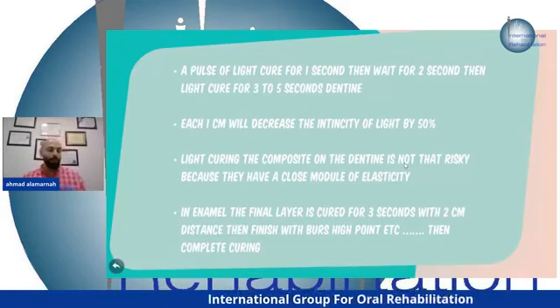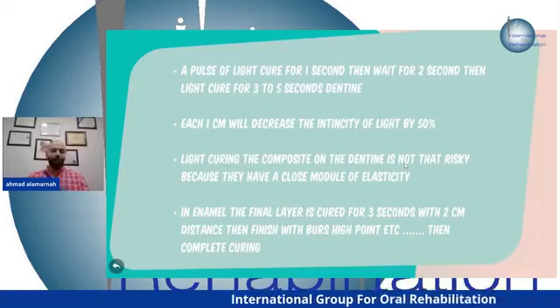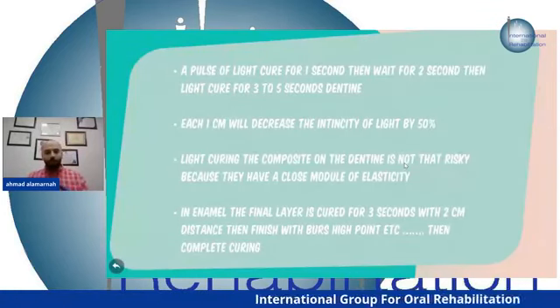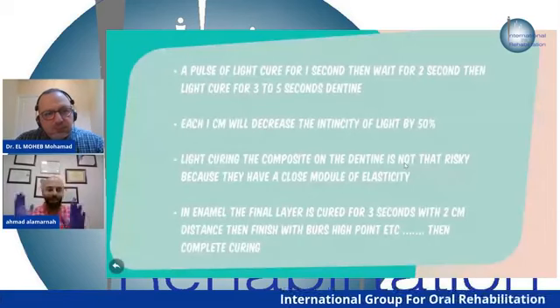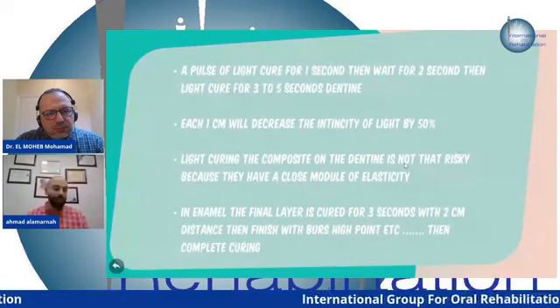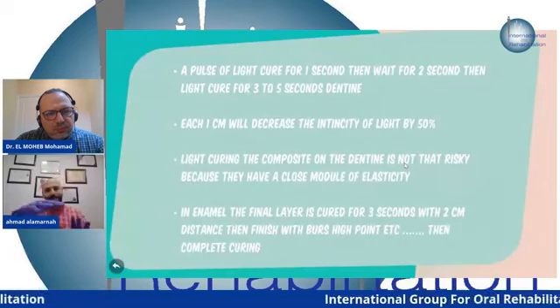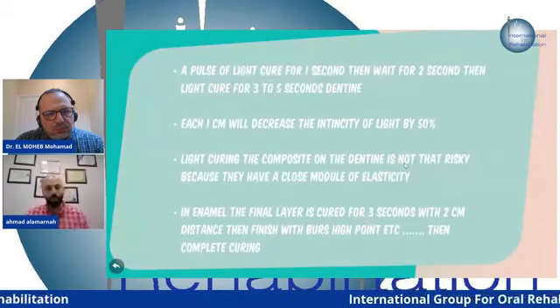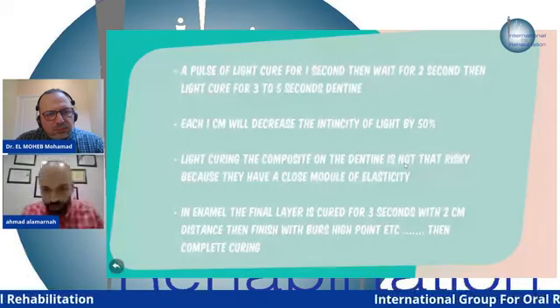Okay, so why do we leave it? It's like dough. If you ever go to the kitchen and need some dough, with some wheat flour and some water, it can't be done by just mixing the wheat with the water. You have to knead for like 10 minutes and leave it to rest for at least 30 minutes. The same thing happens with anything you do. For the composite, you have to leave it to rest at least 5 or 6 minutes. From the time you finish your occlusal check and trimming of the excess material, it will pass 1, 2, 3 minutes, and then you complete your light curing. This will let the material rest and retract toward the enamel, not causing a cohesive fracture and full shrinkage, okay.